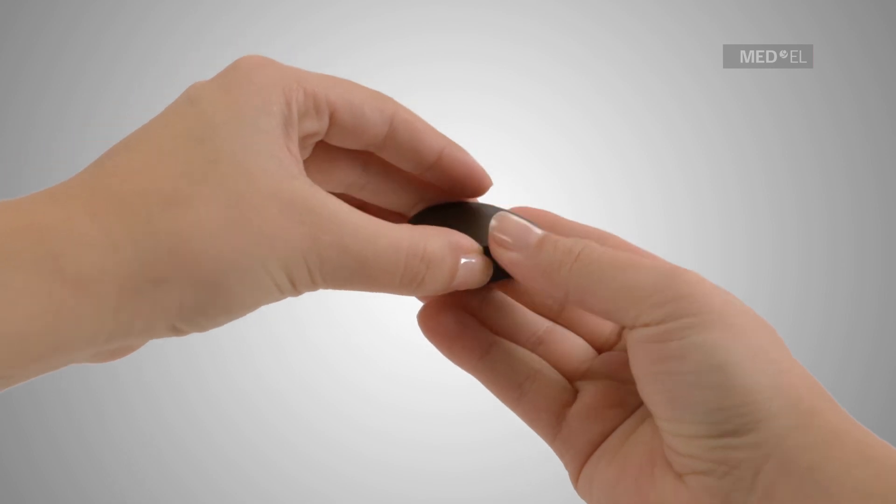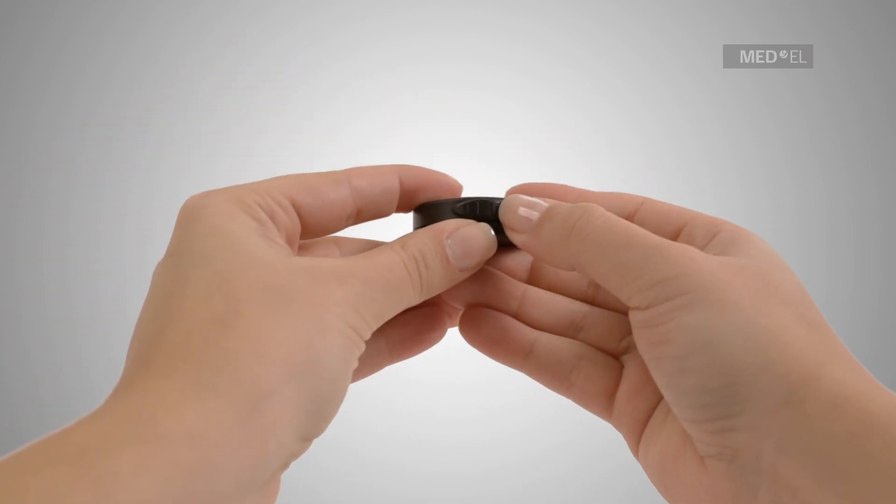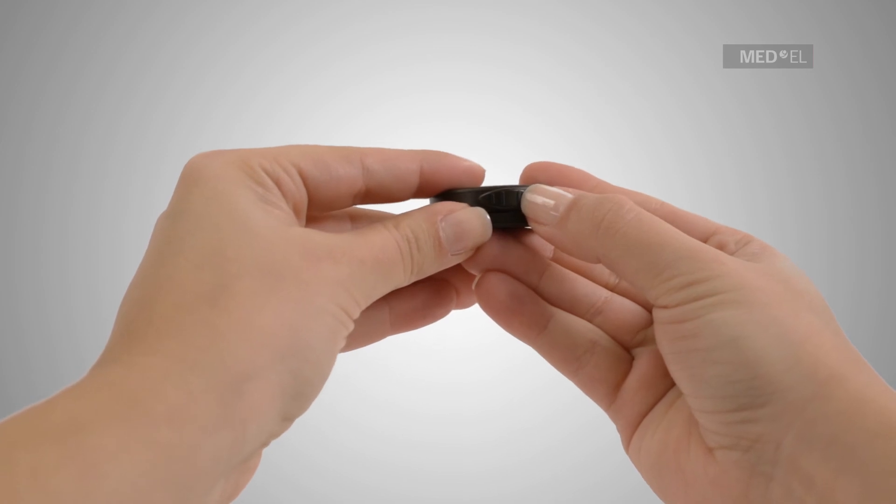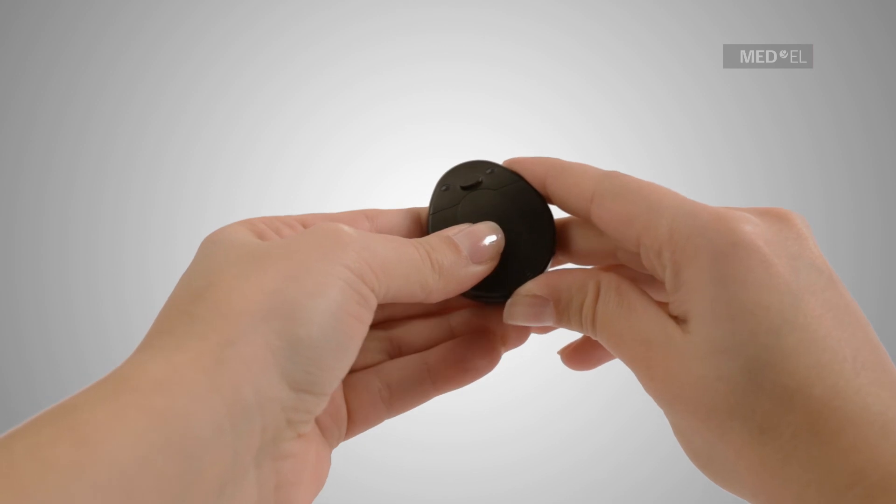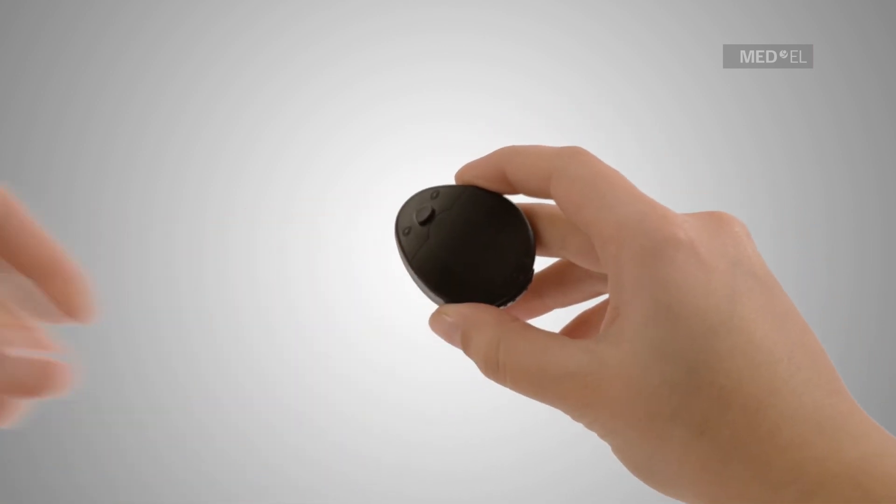The battery pack should come in at a slight angle against the backside of the control unit before being gently pressed towards the control unit. Once at rest, move the switch toward the left to lock.